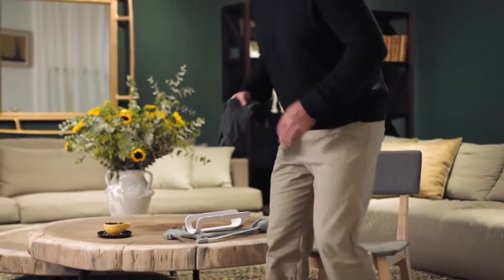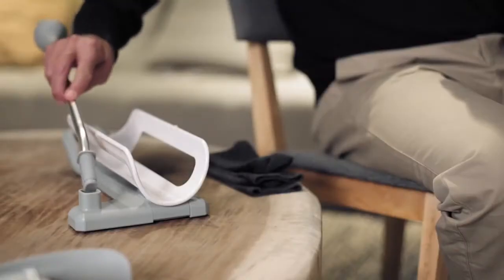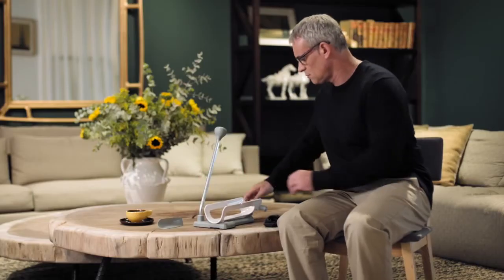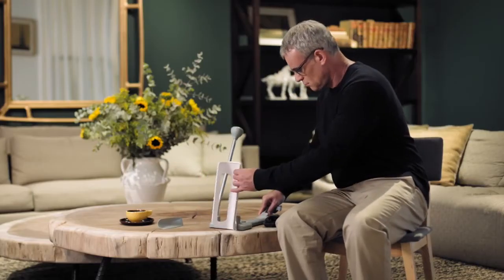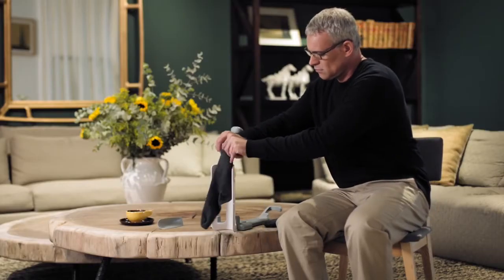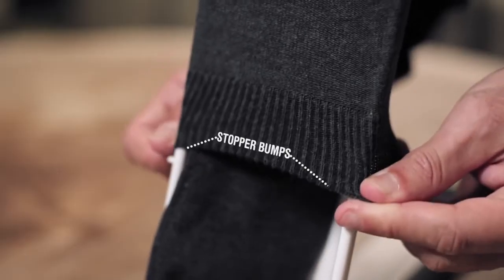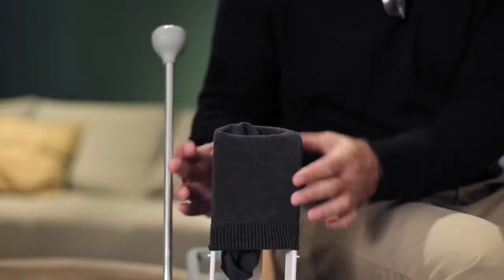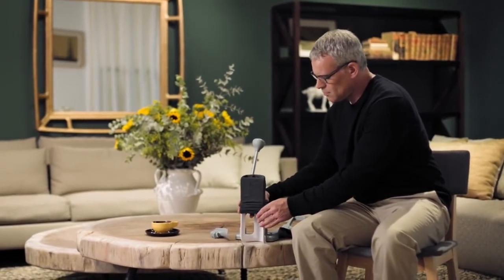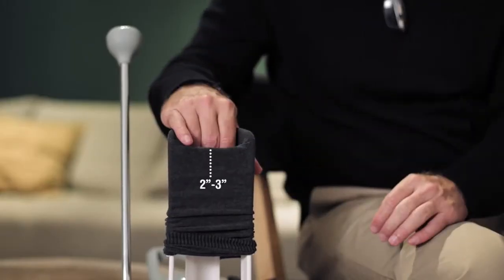Now, let's get started! Attach the handle to the base until it clicks. Raise the Socky arm to an upright position. Place the sock over the Socky arm, heel facing towards you, up to the stopper bumps. Press the sock down over the arm, leaving the sock 2 to 3 inches loose to make room for your foot.